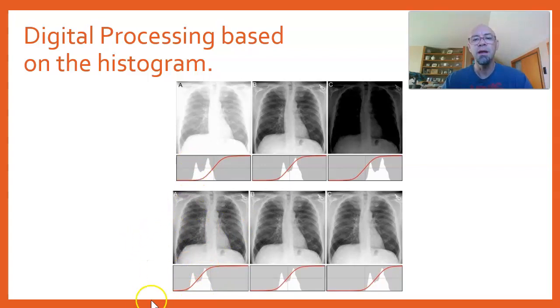So here it's too white, no problem. We're going to take our ideal shades of gray, which is that straight portion of the red line, and move it to match my histogram, and we get a perfect image. Here it's already perfect. We don't need to move it. Here it's too hot. This is too overexposed. So what do we do? We take our perfect straight line and we move it over to match my histogram, and I've gone from overexposed to perfect image.